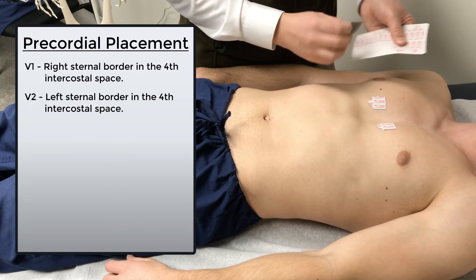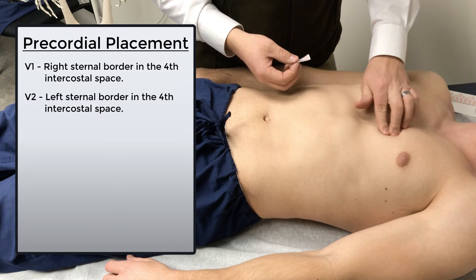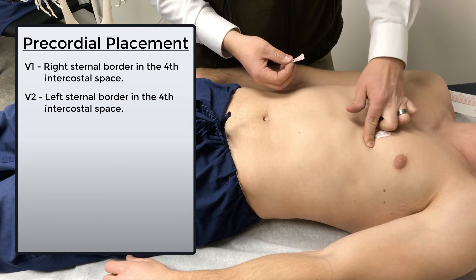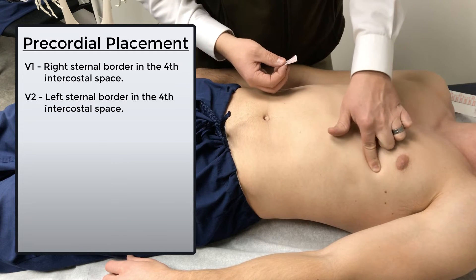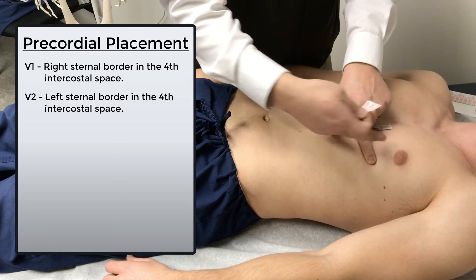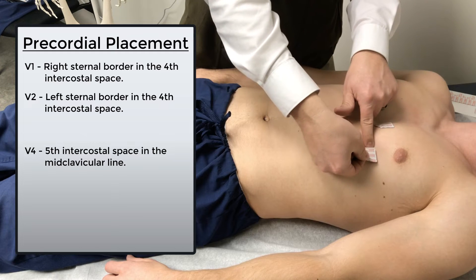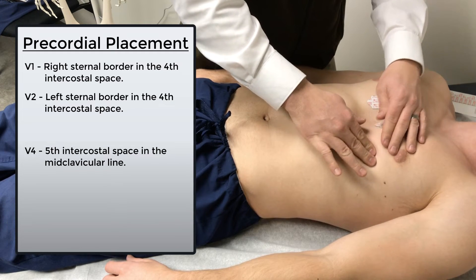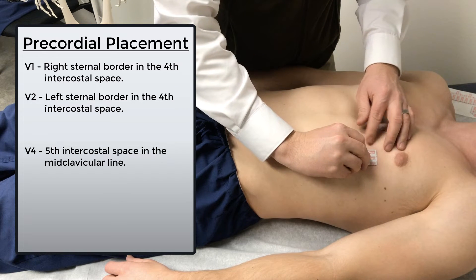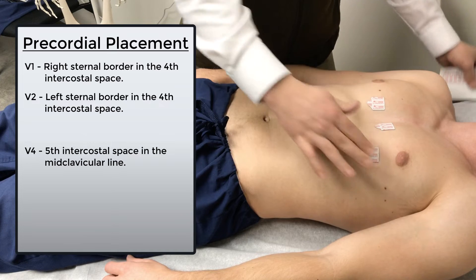I usually skip ahead now to V4. Here's the fourth intercostal space — I'm going to go down one rib space into the fifth intercostal space, and follow that out to the mid-clavicular line. So V4 should be in the mid-clavicular line in the fifth intercostal space. That is going to be V4 — mid-clavicular line, fifth intercostal space.